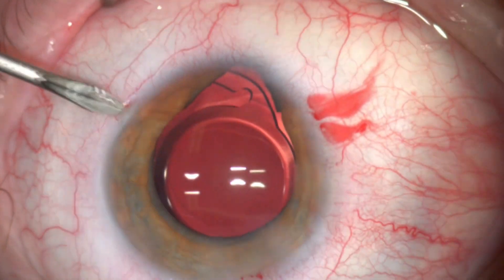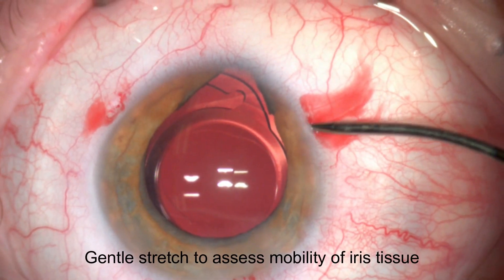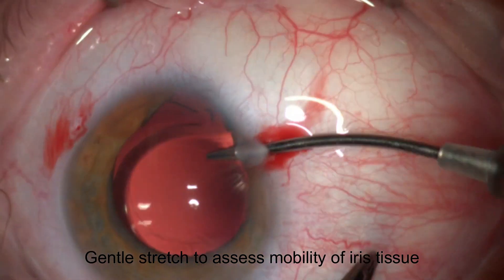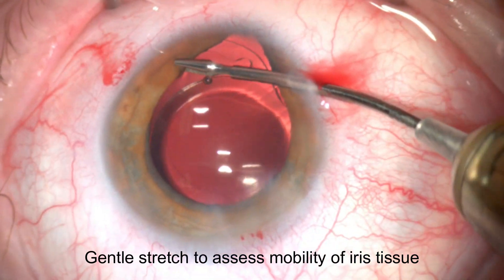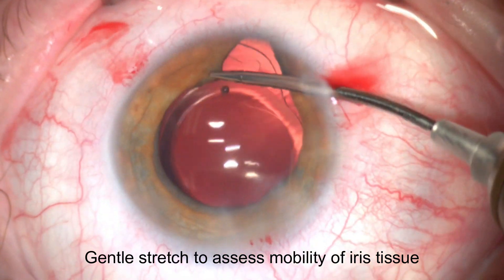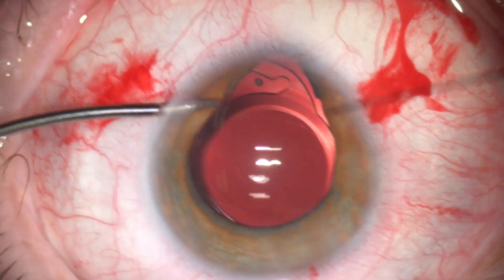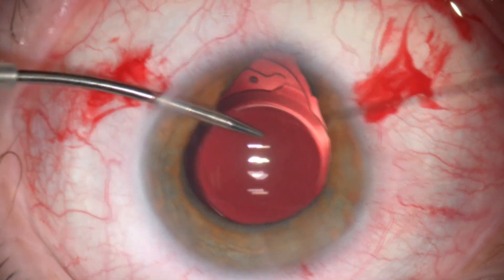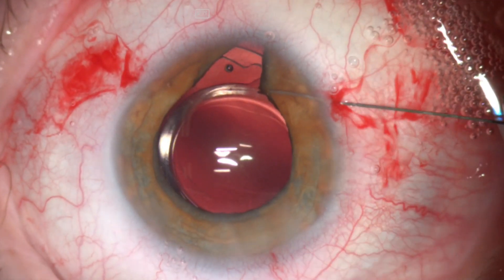Then we move to iris repair. Two small paracenteses were made. At this stage, a gentle stretch of the iris tissue is performed to assess its mobility and to make subsequent suturing easier, especially in cases with dehiscence in the iris tissue. I like to do that from both sides.